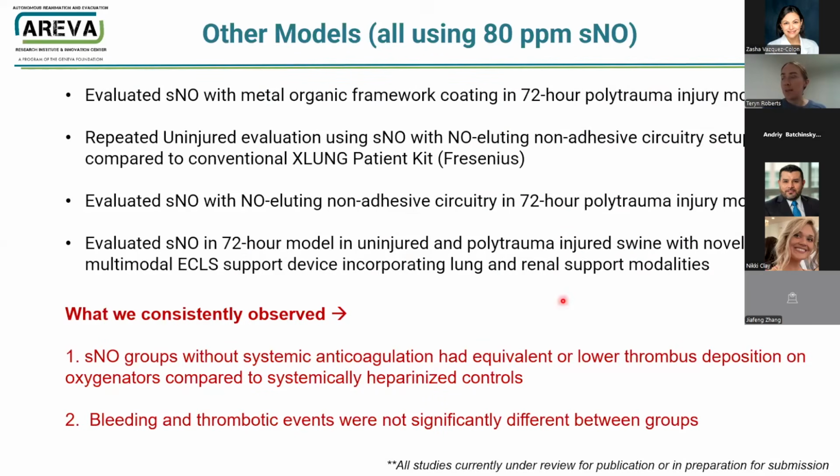So since this study, we've also evaluated the sweep gas NO with the same coating, same dose, in a 72-hour polytrauma model. So the animals encounter pulmonary contusion and hemorrhage prior to start of ECLS. We've also repeated the study in both uninjured and injured animals that get the same sweep gas NO, but with a different type of coating that's a non-adhesive surface and has a nitric oxide eluting compound. And we've also done some work looking at the combination of lung and renal support using only sweep gas nitric oxide as the anticoagulant approach, with just the manufacturer heparin-coated circuits.